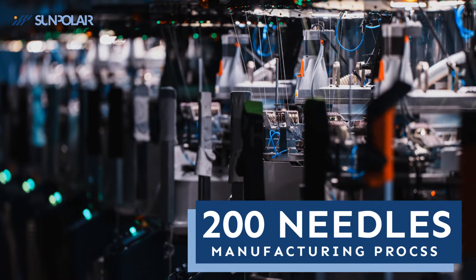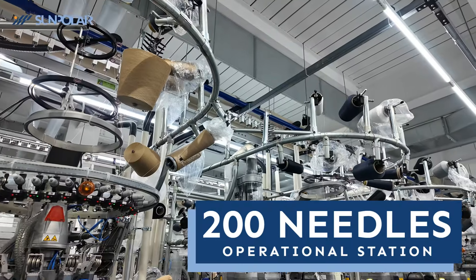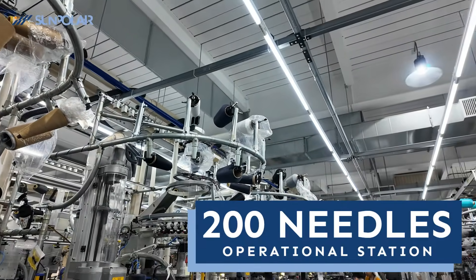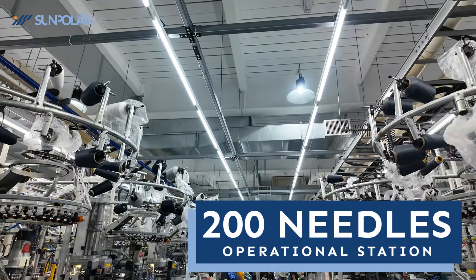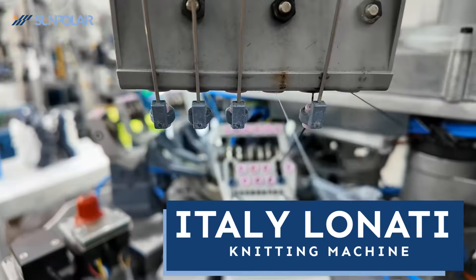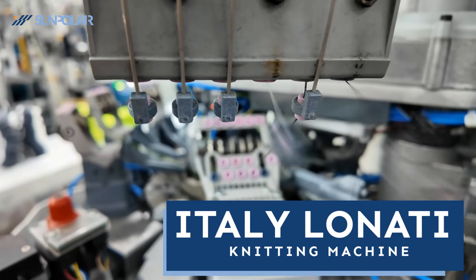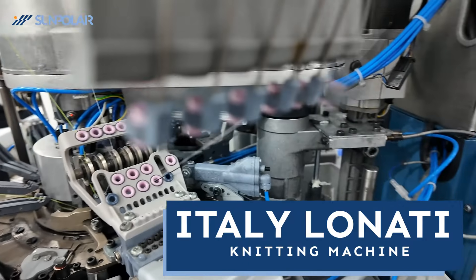200 needle machines are mainly producing for general compression socks. At the 200 needle operational station, precision and efficiency work together to deliver exceptional quality and consistent performance. We elevate our production with the advanced technology of Italy's Lonati machines, ensuring even greater precision and superior craftsmanship.